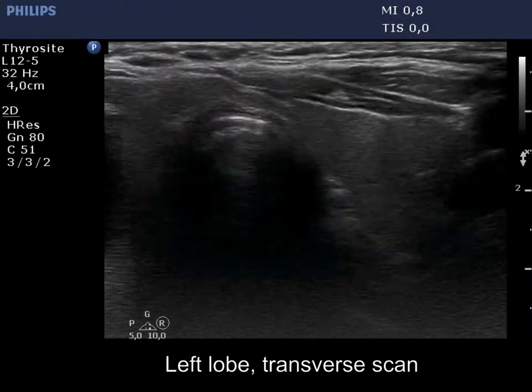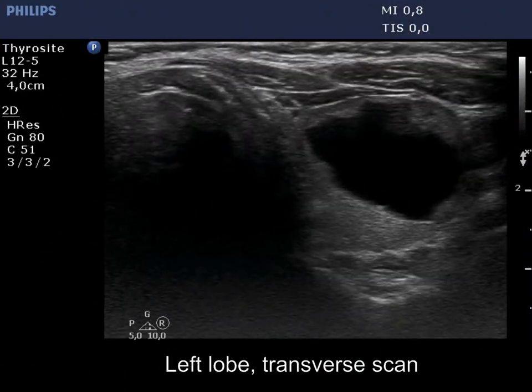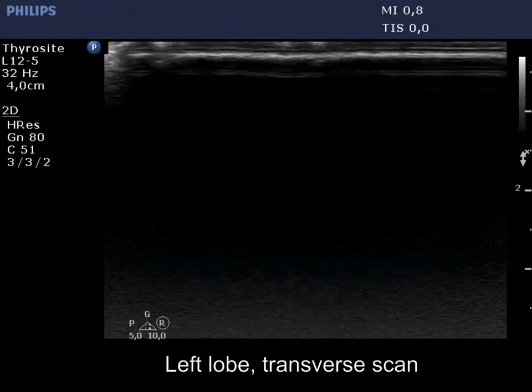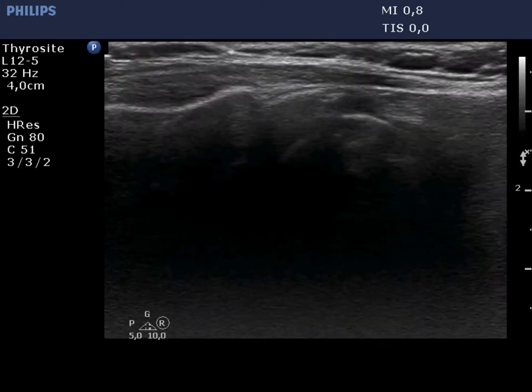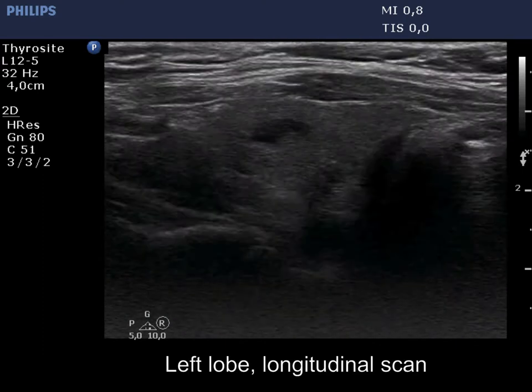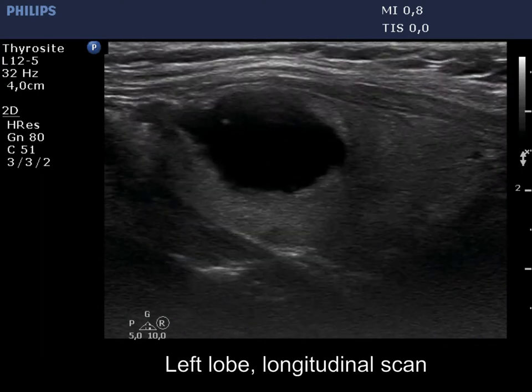The left lobe presents a central type cystic nodule with a much thinner solid part all along the inner surface.